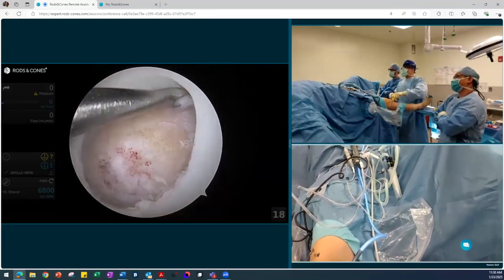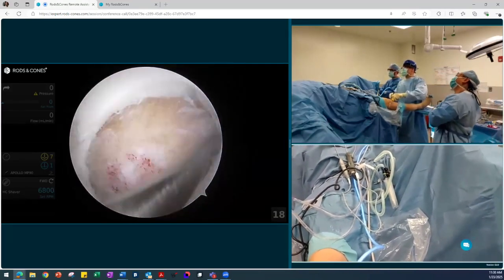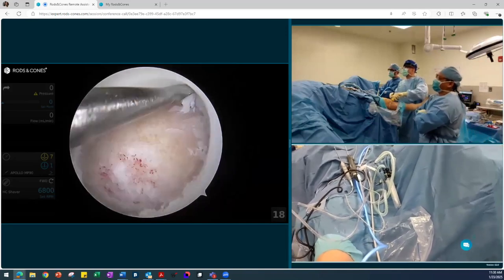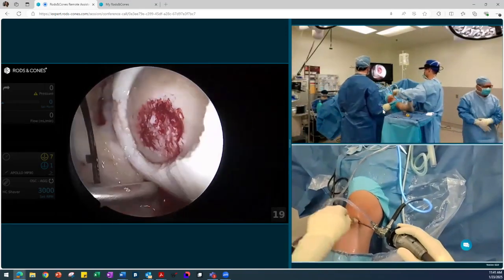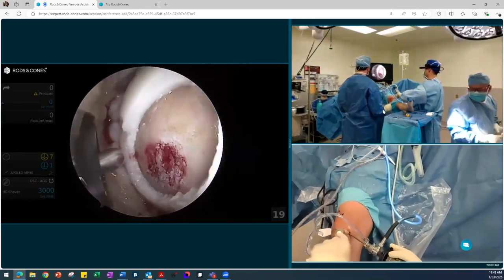Following this, we're going to use the curette. We're almost completed, and then we're going to use a small hand curette to fine-tune this so that there is no elevated edges on the MACI when implanting it. Following this, we're going to use a Fraser tip and irrigation.